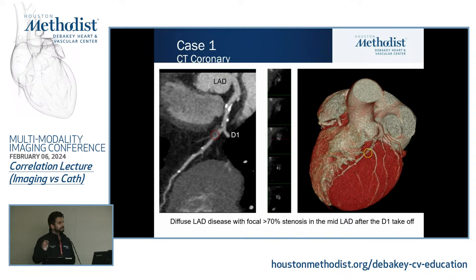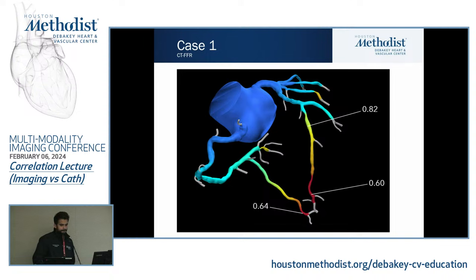I also wonder about CT-FFR with multiple lesions. CT-FFR will decrease as you go more distal, and with the combination of the mild disease in the proximal LAD and then the severe lesion in the mid LAD, that combination of the two may explain the drop. Yeah, the TENNIS registry showed that a translesional gradient of 0.2 is the best predictor of improvement in FFR. Dr. Chang, hold on.